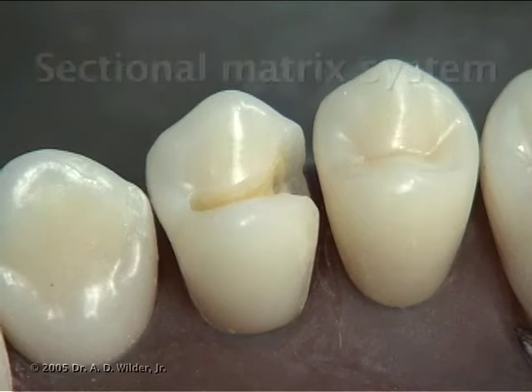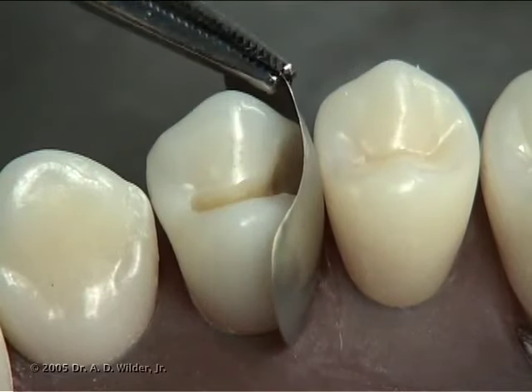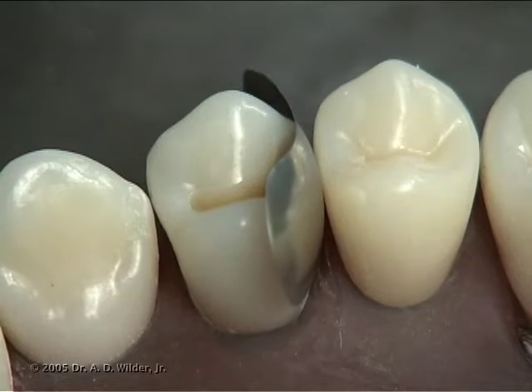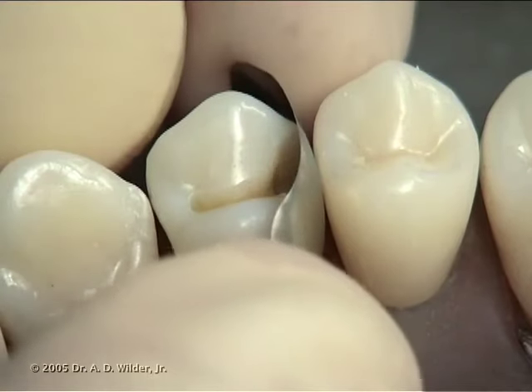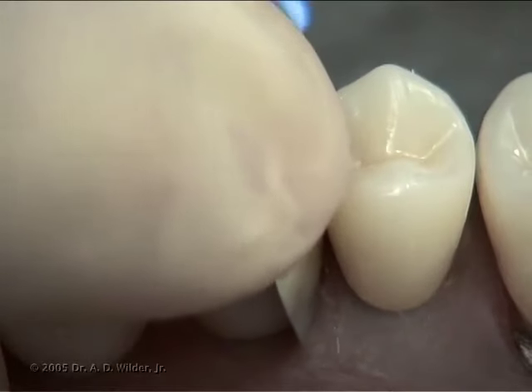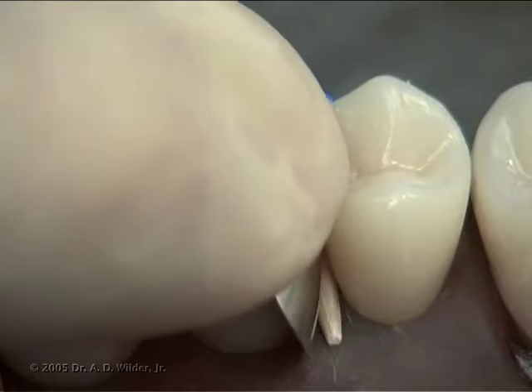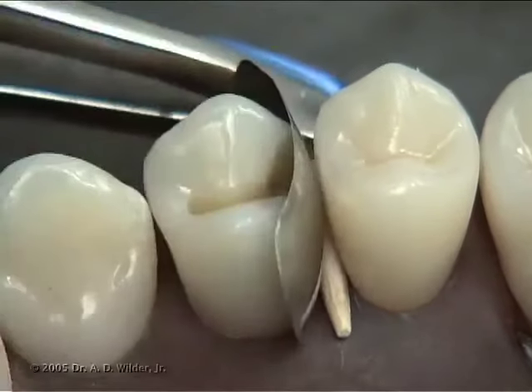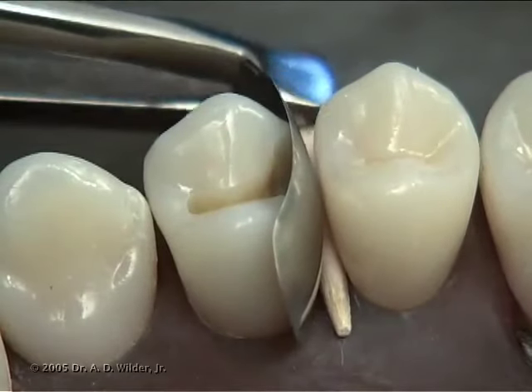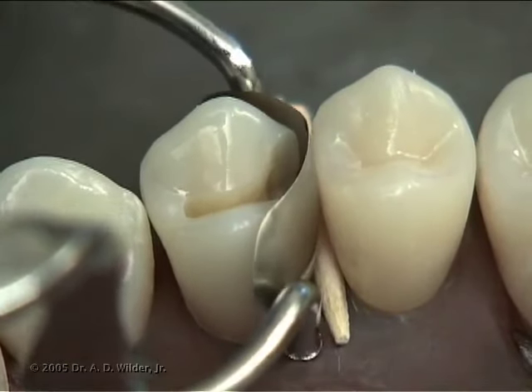After the preparation is complete, place a sectional matrix as seen here, or Tofflemire band if you prefer. Make sure that it's fully seated and the inferior portion of the matrix band is below the cavosurface margin of the proximal box. Reinsert the wedge underneath the proximal contact but outside of the matrix band, so that the band is pushing right up against the prepared tooth.